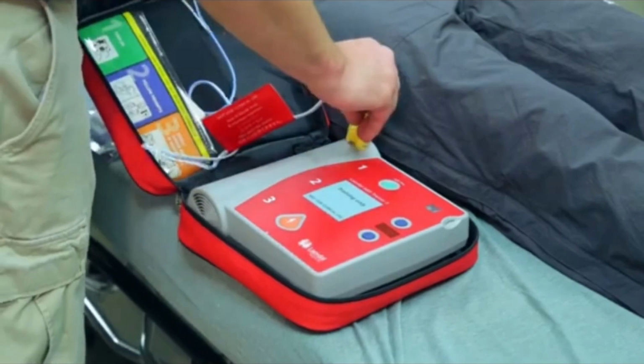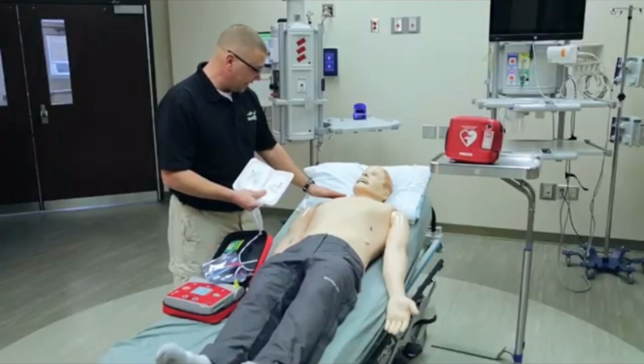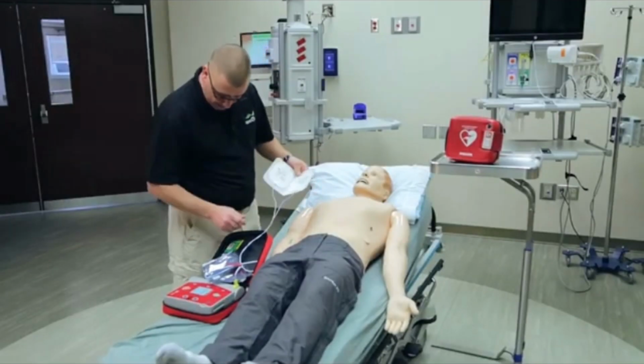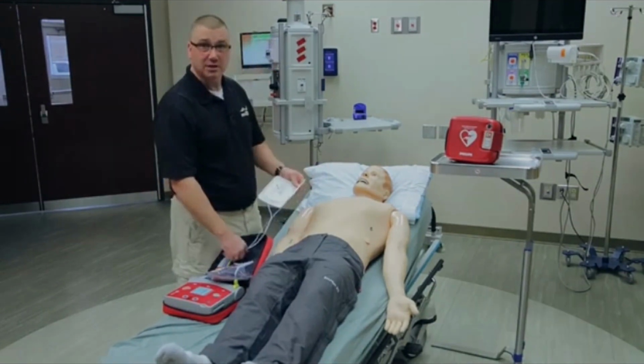Plug in pad connector next to flashing light. Notice in certain AED kits, they may have a razor because there are some guys that are hairy like crazy. And in order to get a proper connection, or for those pads to get a good sync, or a good analysis of the rhythm, you must shave that chest hair. So guys, if you got a hairy chest, shave it, please. I'm just saying, shave it. In the event they have a lot of hair on them, a razor is provided so you're able to scrape it down. It does not have to be close shaved.